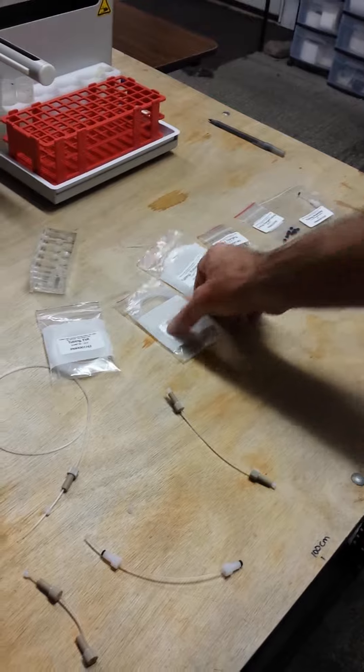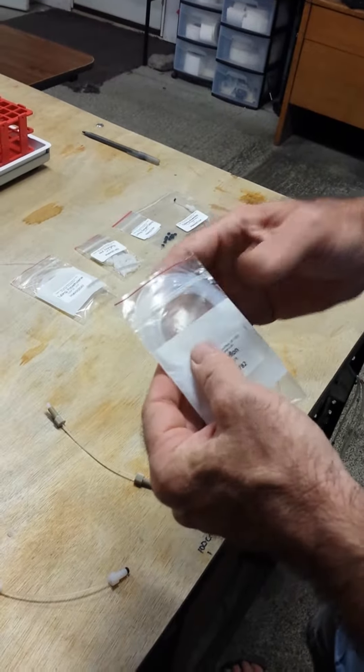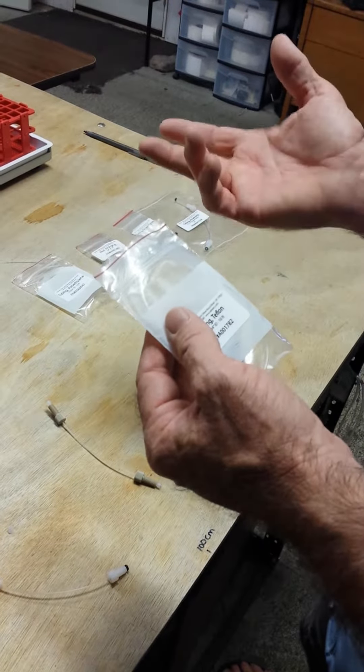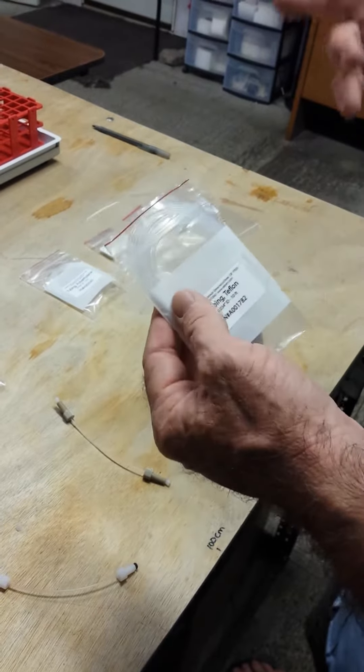On our systems we prefer Teflon, only Teflon. You have all IDs available with Teflon. You can have as little as 0.015 all the way up to 0.06; you can flange it all.